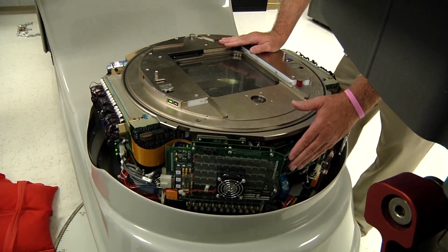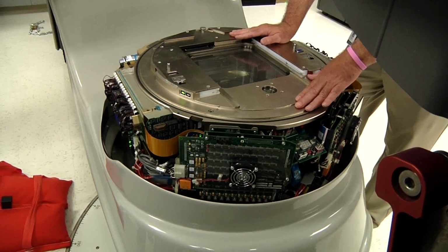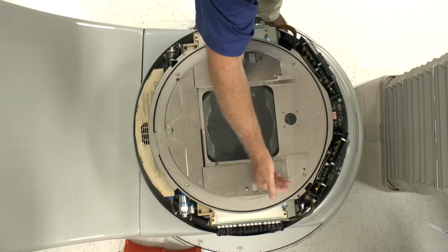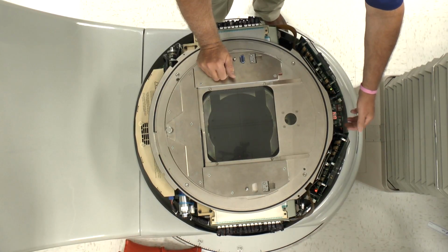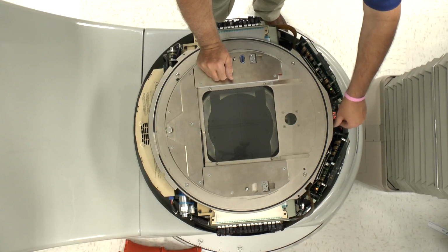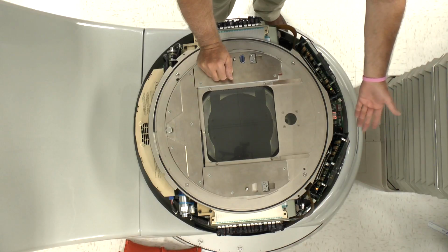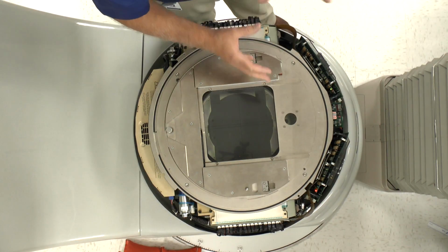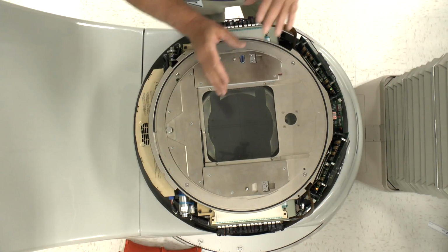A lot of times you're going to play with the service panel because you have to move a leaf. A leaf might get stuck. So if a leaf gets stuck, you go over to the A side or the B side by flicking the switch back and forth. You have two knobs here. This one's the 10s, this one's the 1s. So we'll do leaf 7, and you can move it. A warning with this board: when you move the leaf, it will move the leaf.